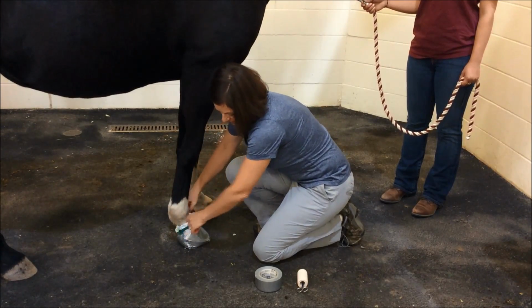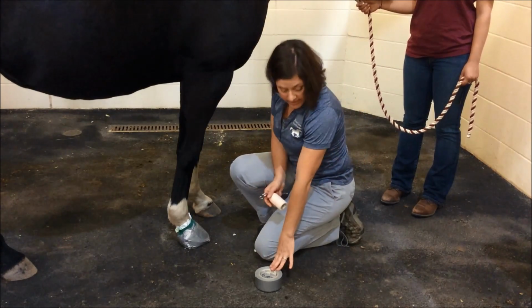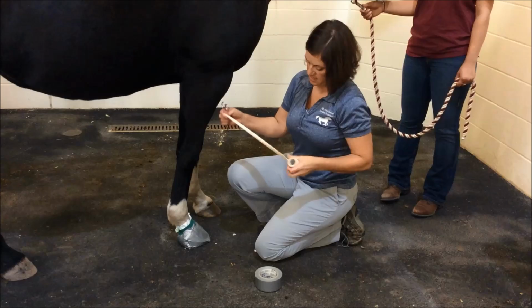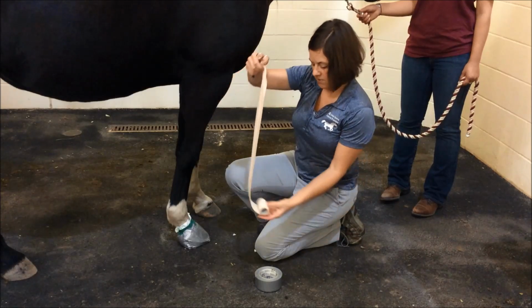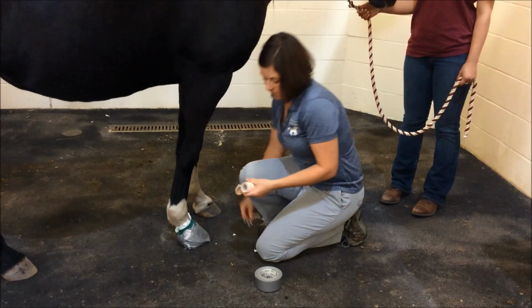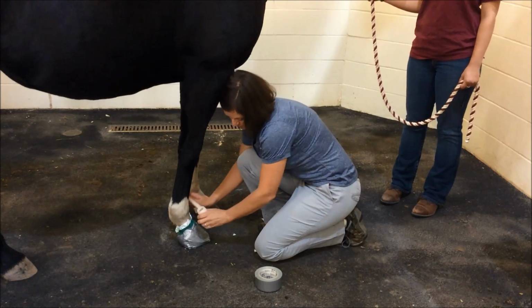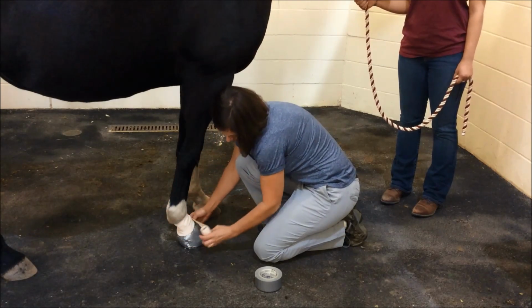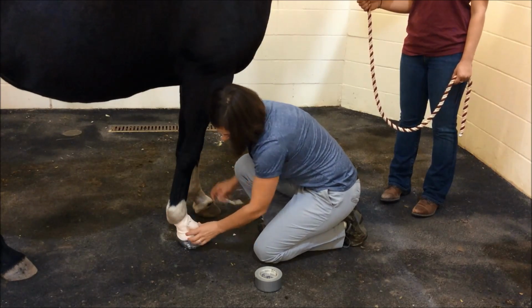And then again, if she's got a hoof abscess, we're going to have her in a well-bedded stall with lots of shavings. So I'm going to come back. You could use duct tape for this. I prefer to use my Elasticon. And my unrolled and re-rolled so that I don't have any tension on the tape. The only purpose for this is to keep shavings out of the wrap, and I'm just going to again lightly lay that over the top.